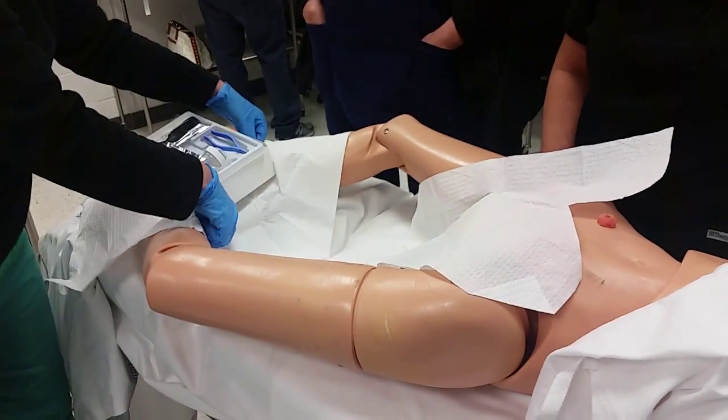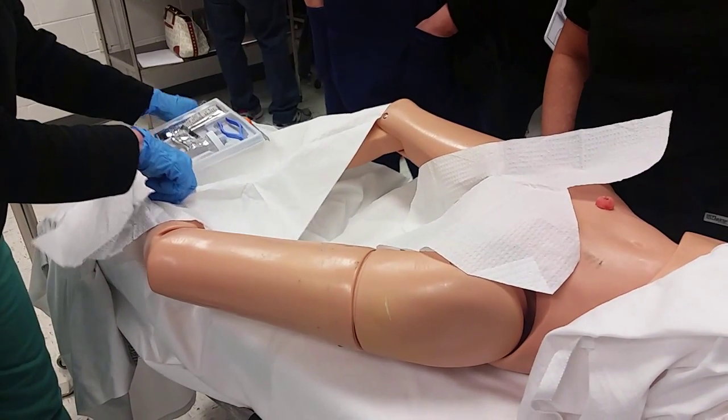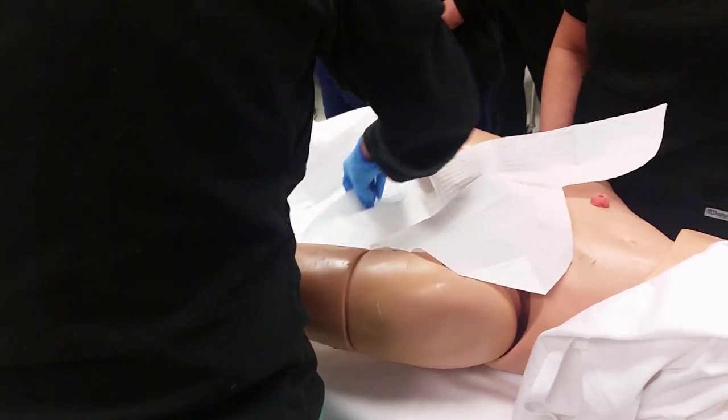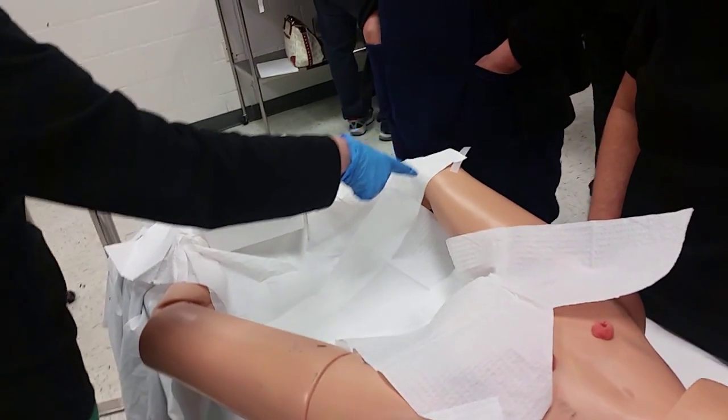When you're doing it, you can turn this before you start. You've got to practice and figure out your way. See, now it's off. Ultimately you want this sheet up on top of that one, because this is still a one-inch border that's not sterile.